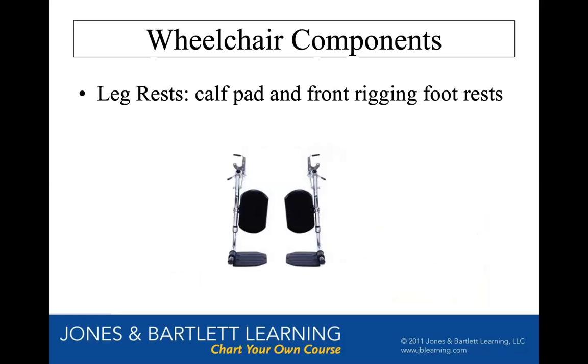There's different kinds of leg rests. So you can see these are really the most supportive type of leg rests. These have something to support the back of your leg, a calf pad. So your legs have support. They have folding foot plates.